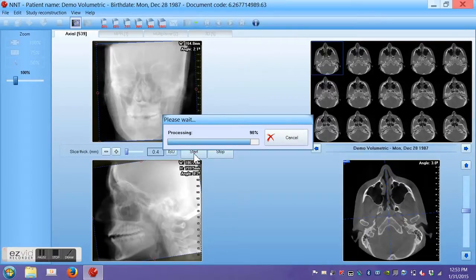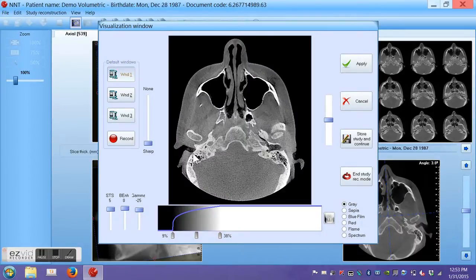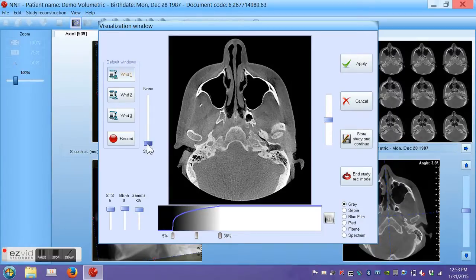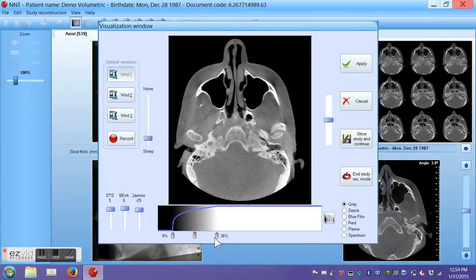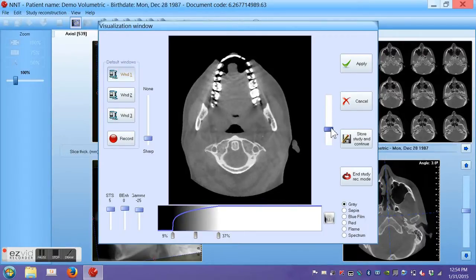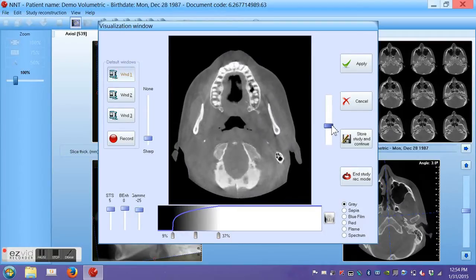We have now extended everything and reoriented. I am going to press Start and the visualization window opens. This is where you set the light and dark values and properties of your image. If you look right here, you see a lot of graininess. I like to reduce the sharpness just a little so that goes away, but the remaining image is still quite clear. I can make the image darker and lighter by adjusting these sliders. I can slide through my axial slices with this slider and see that I am getting the type of contrast that I want to see. Click Apply.